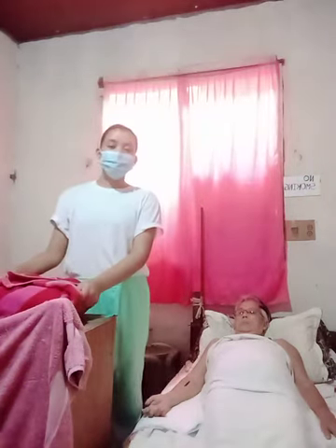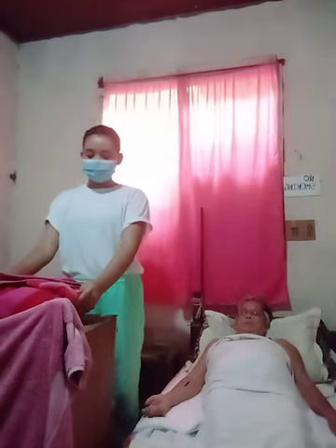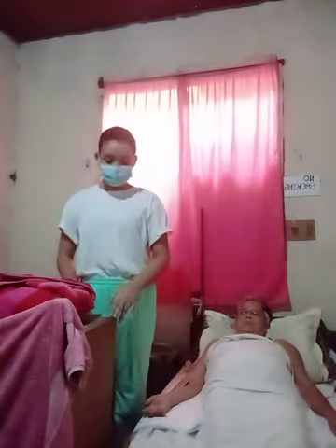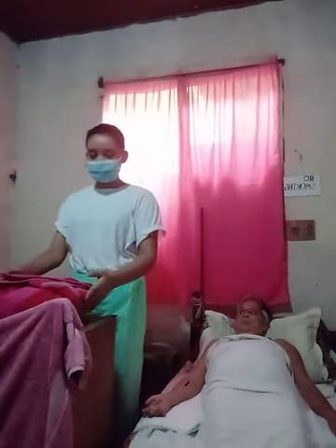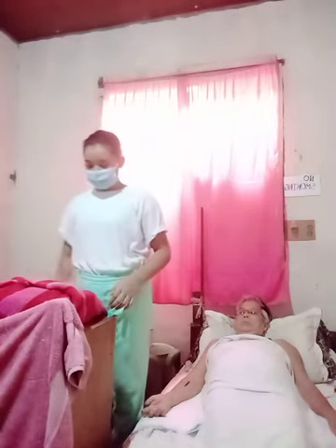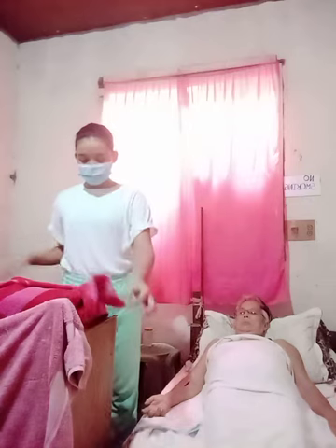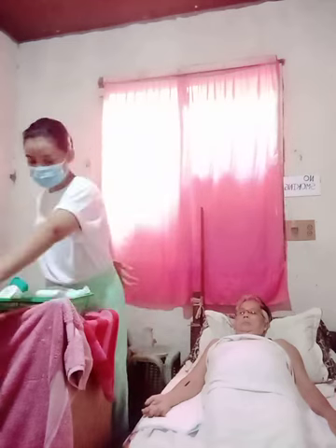Open a sterile dressing tray or wrap the sterile supplies and put them on a bedside table. After that, apply the dressing. In applying the dressing, we have a dry dressing. Carefully, since this is sterile, we're going to touch only the end of the sterile wrap, like this.